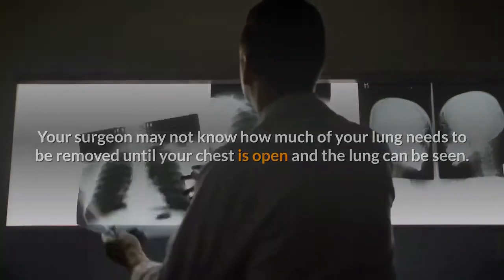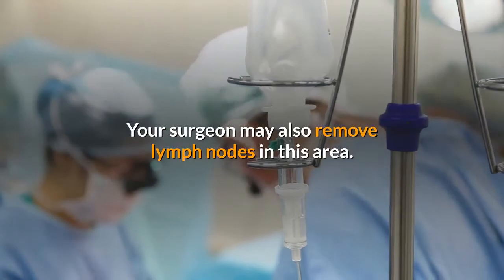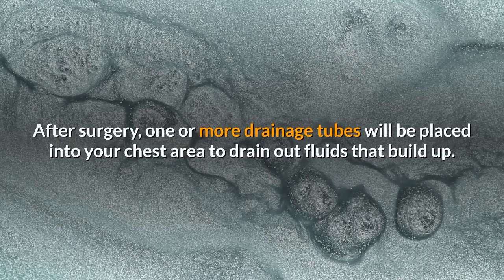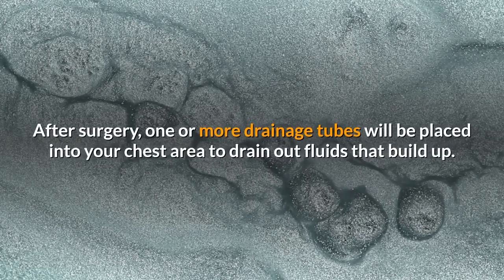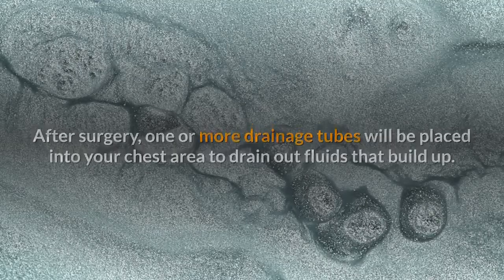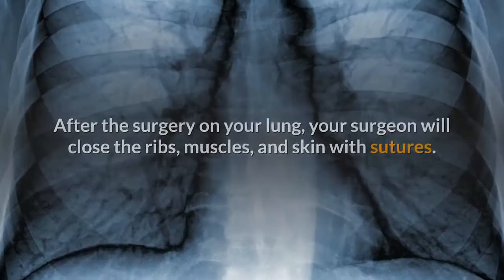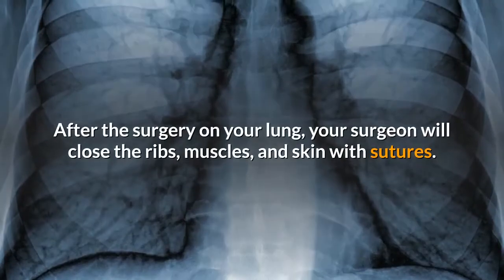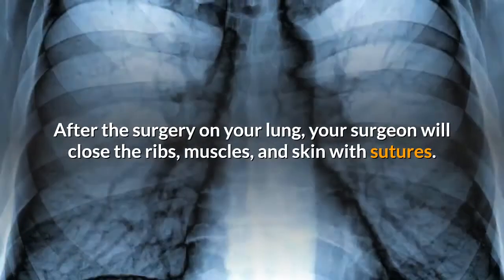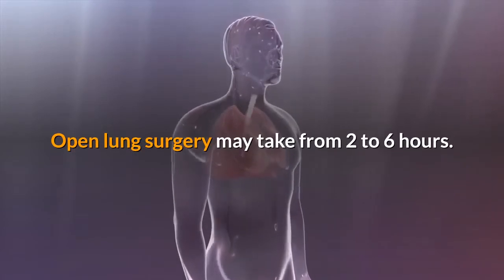Your surgeon may not know how much of your lung needs to be removed until your chest is open and the lung can be seen. Your surgeon may also remove lymph nodes in this area. After surgery, one or more drainage tubes called chest tubes will be placed into your chest area to drain out fluids that build up. Your surgeon will then close the ribs, muscles, and skin with sutures. Open lung surgery may take from two to six hours.